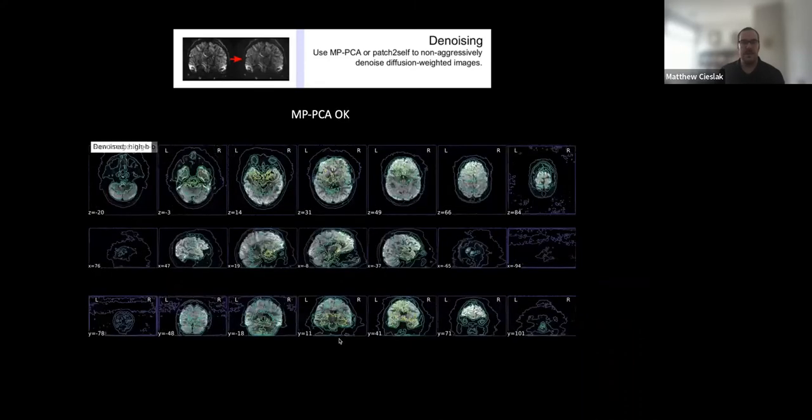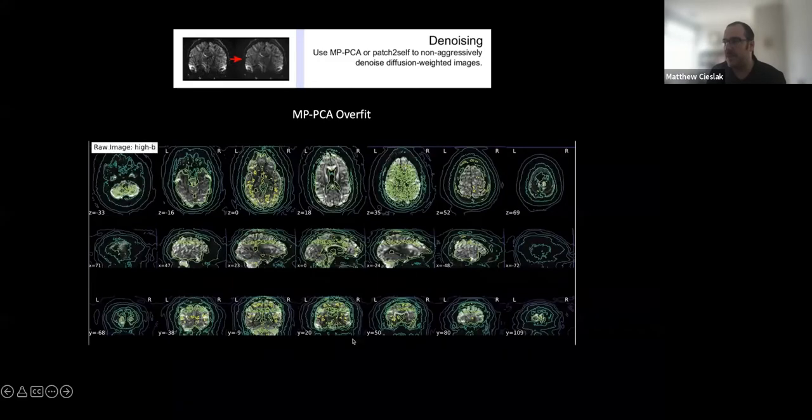This next one is an MPPCA where we don't see those in the image, besides eyeballs, but that's okay. You don't see individual ventricles or anything like that in this version of it. If the slides were a bit higher resolution, you may also see the images, both in the previous one and in this one, go from having some fairly clear noise in them to looking much better.